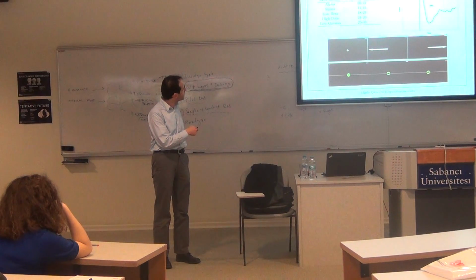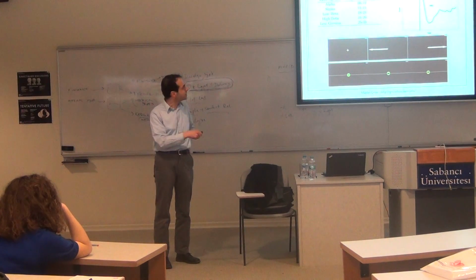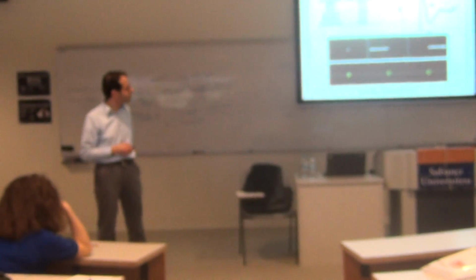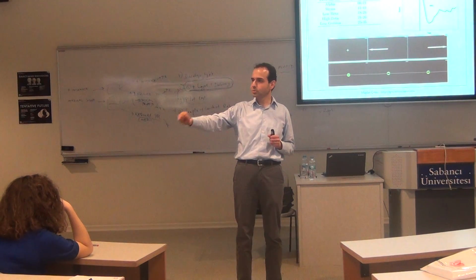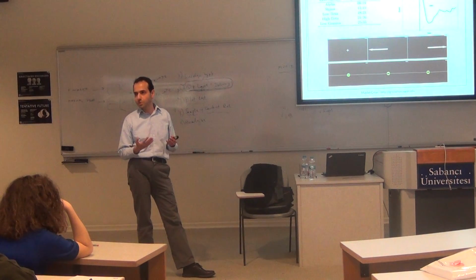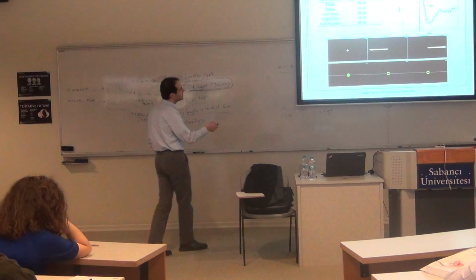So that's another thing that can be exploited well. So you can look at signals at different frequency bands, and this will give you one picture of that. The signal at this frequency band, which is called alpha band, as you show the subject a cue to execute some kind of motion, what happens is that the power of this signal decreases just after that cue is shown. That's a pretty characteristic pattern generated by it. More interestingly, this signal is generated even if I don't actually do the motion, but I just imagine doing the motion, which is of course quite interesting and useful because we want to use these types of interfaces for people who actually cannot do the real motion. So you can come up with brain-computer interfaces using things like that.